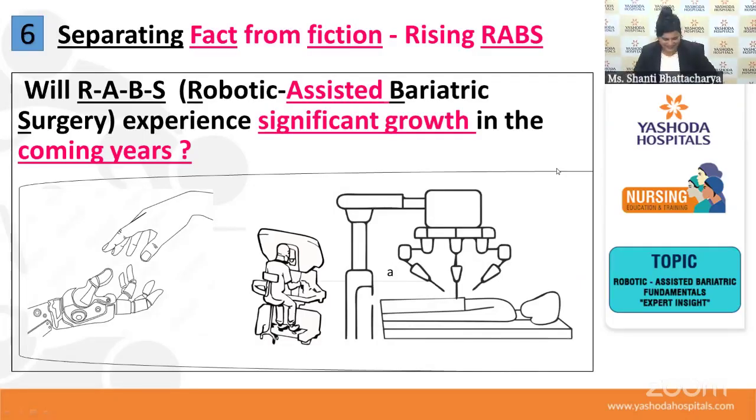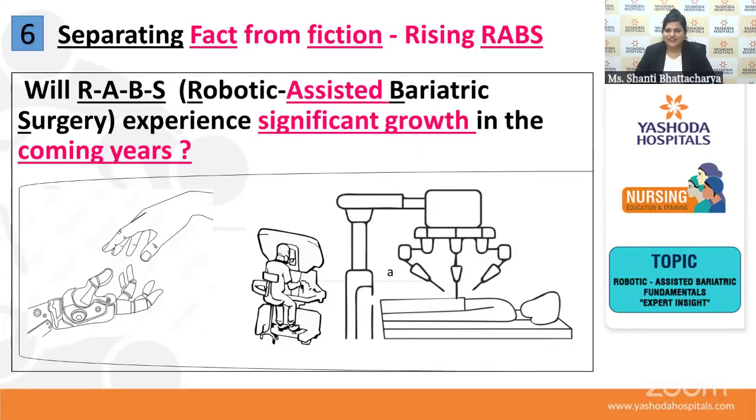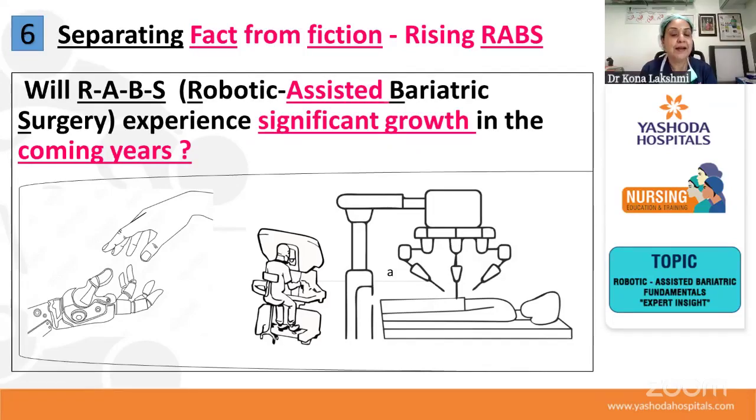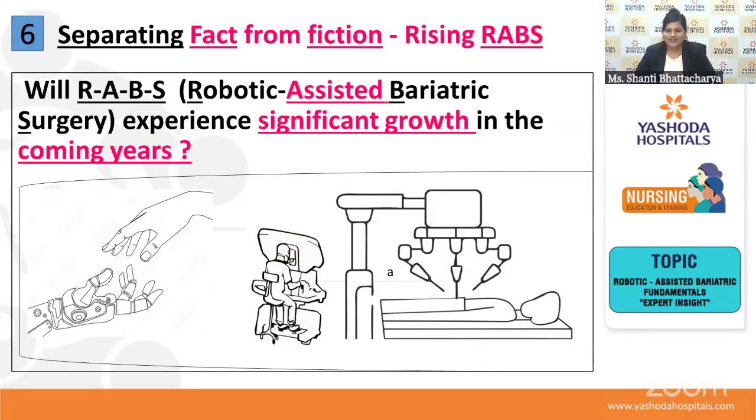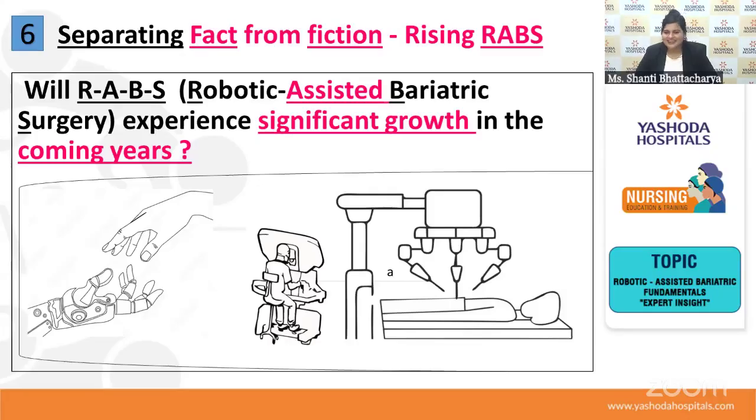That is a very beautiful statement I could hear from you today. Something which helps me navigate the difficult steps and complete this surgery in the same minimal access way rather than opening the patient, because opening the patient is such a painful thing. We can complete the surgery, but later the patient has so much pain, wound infections, length of stay, hernias, everything increasing. So robo is an answer to a lot of surgeons' prayers, and a helpful tool for us.